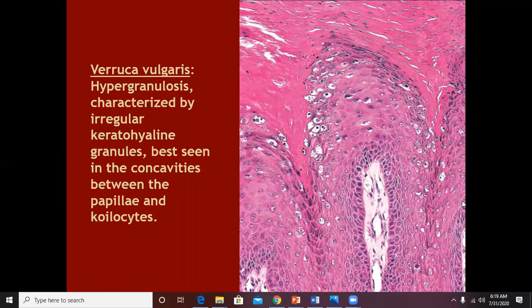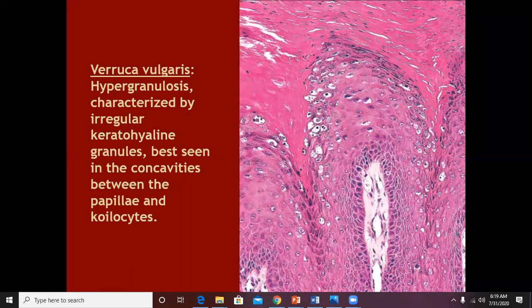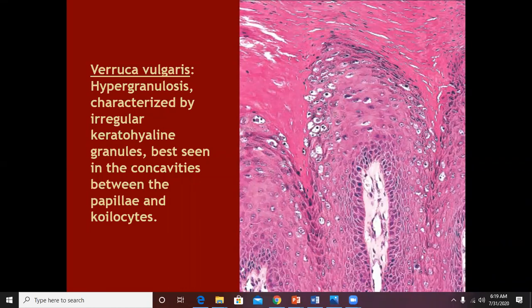So we have now discussed three typical features of a common wart: number one, thick hyperkeratosis; number two, papillomatosis; and number three, hypergranulosis.